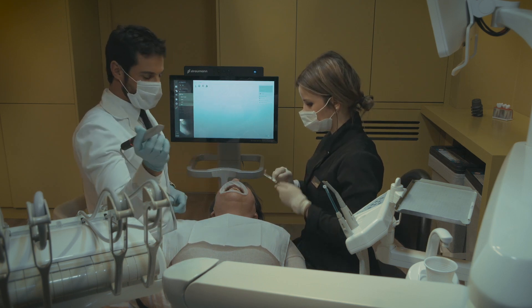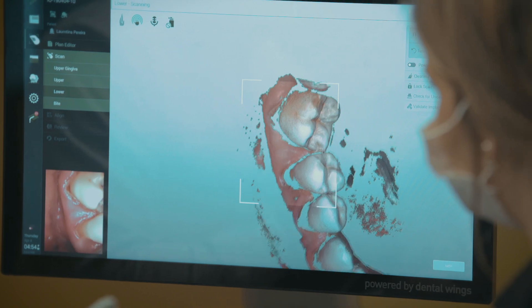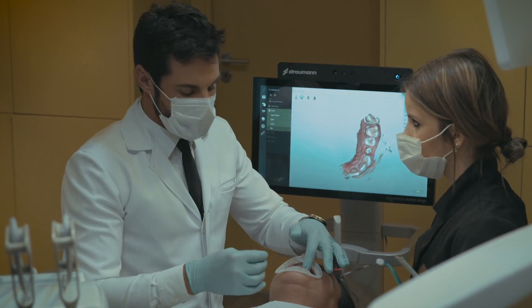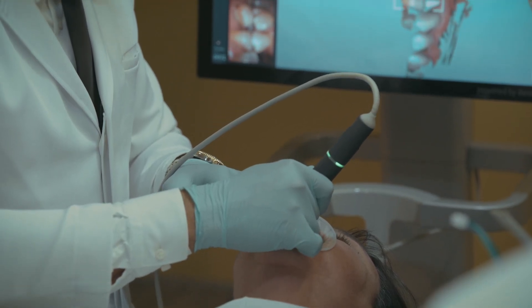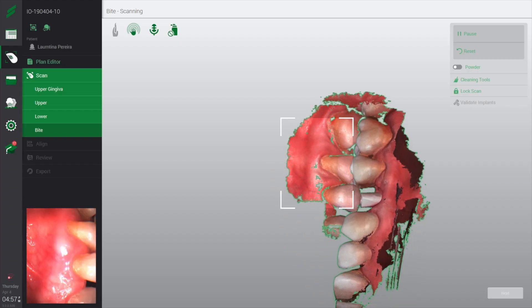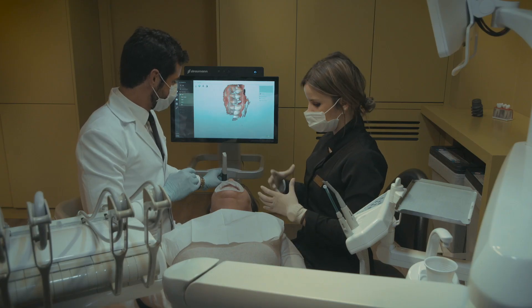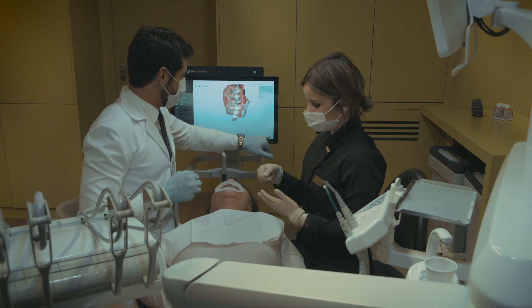Now let's go to the lower. In this case, our scan body interferes with the occlusion — with the bite — so we need to remove it before asking the patient to do the bite. We already had the upper jaw as a reference, and now we just have to scan the inferior until we have the model. And because we always have these lights, we can be more centered on the patient — a green light indicates that the scan is okay.